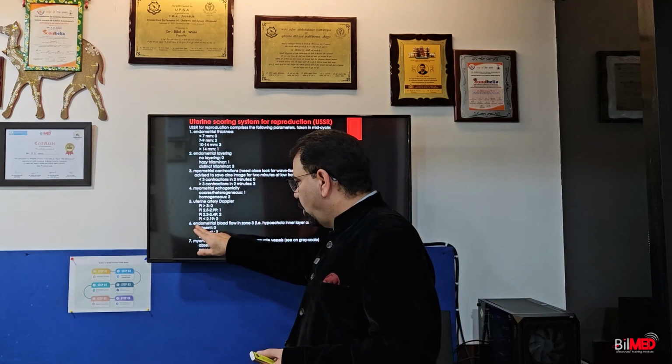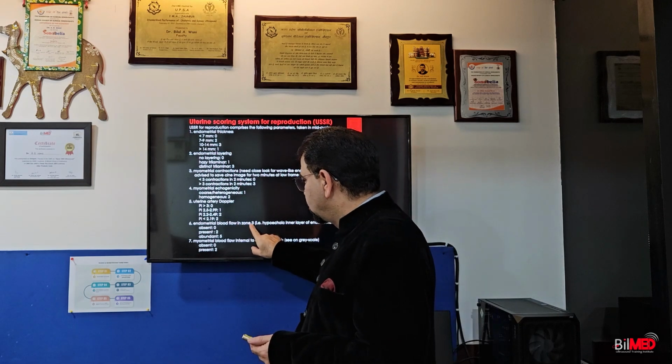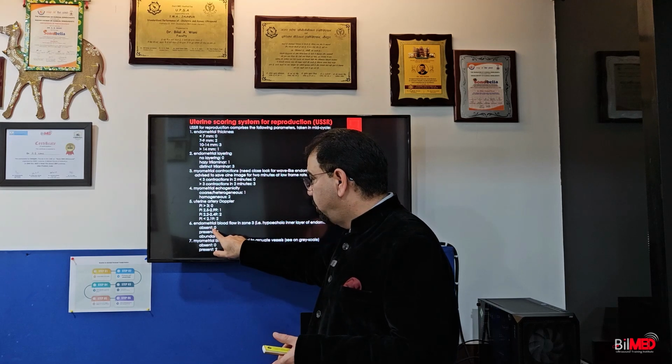And very important, where should the endometrial blood flow be? In zone 3. Not talking of zone 1 and zone 2. And what is zone 3 now? Recall it. You can rewind the video and go to zone 3. It is there in the endometrium. So if the blood flow is in the endometrium, present is 2, and if abundant over there, 5. But what is important? If absent there, then the score is 0.